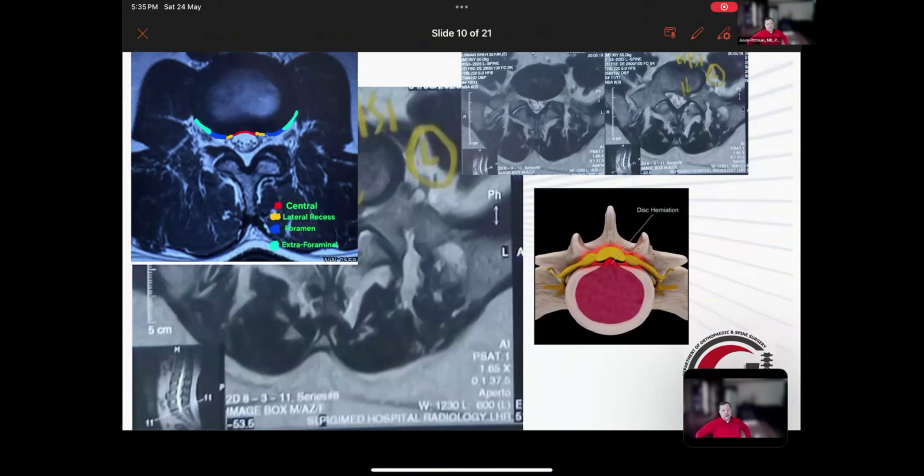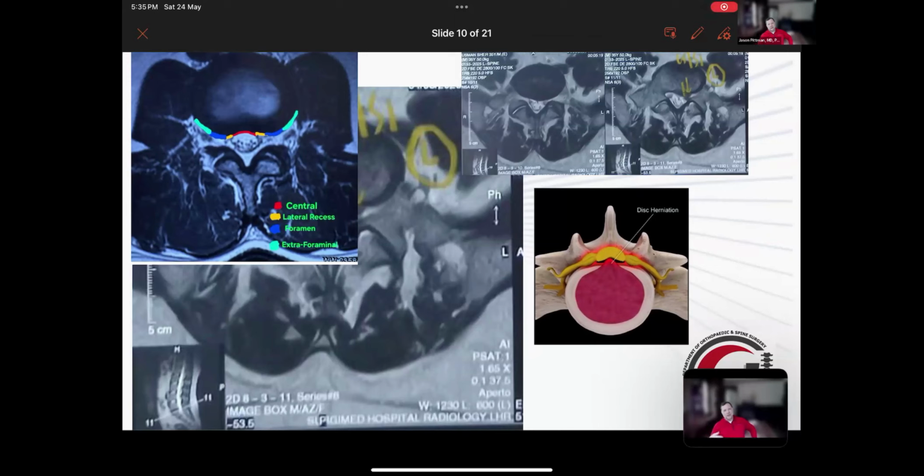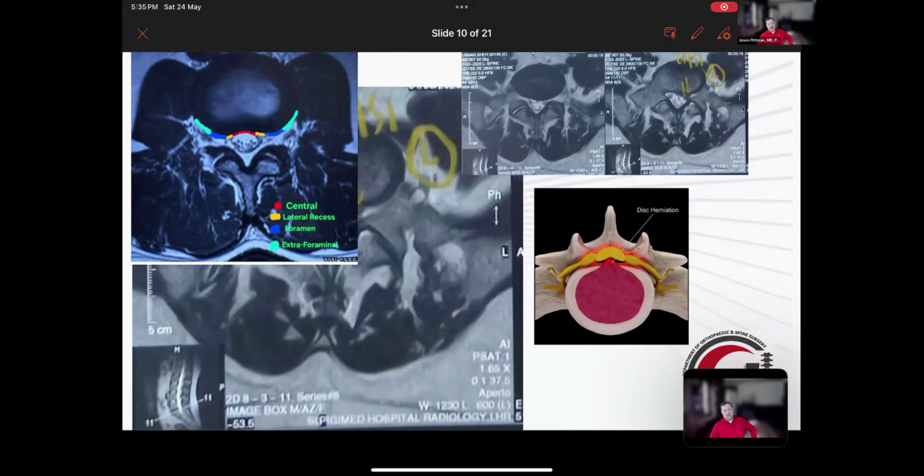And then, I agree that if you are aggressive about letting the fluid decompress before you close the wound, like leaving the cannula in place, applying just some gentle pressure across the surgical site to express fluid, these are simple things. And my decision to remove the drain, there's no real thought process behind it. It's like, it's been an hour and a half, minimal output, drain can come out. And I think that is ultimately what drives people to just eliminate the drain altogether.